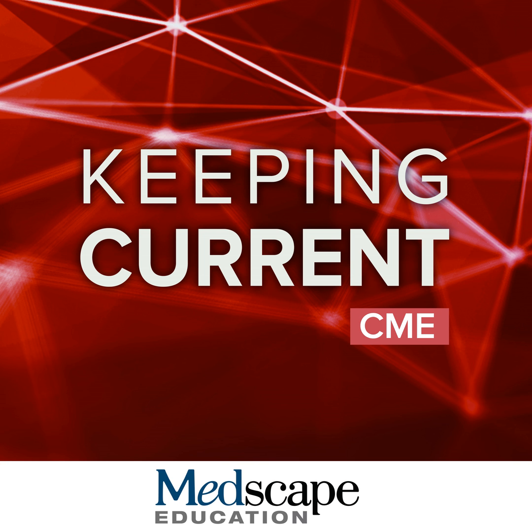This is a patient from the ICU. You can see the pleural effusions, so the patient can't hold their breath. We ran real-time cine imaging, so you can see the images are less sharp, but it still gives you a pretty good idea of function at a frame time of 65 milliseconds. And this is carried out free breathing without any ECG triggering.